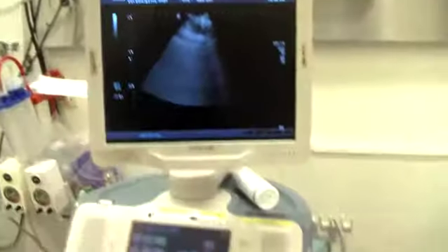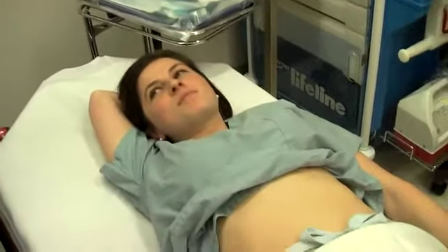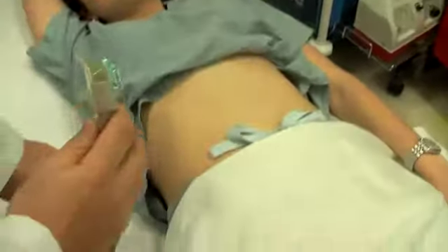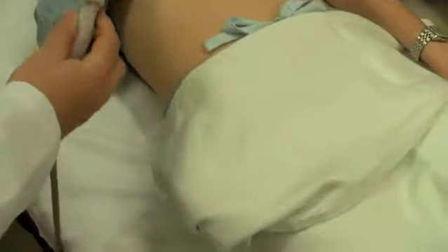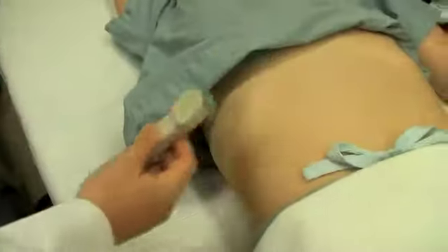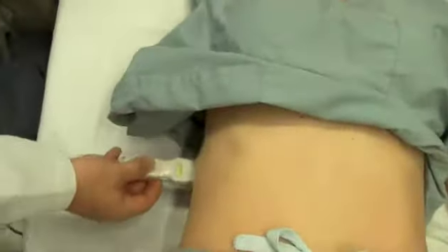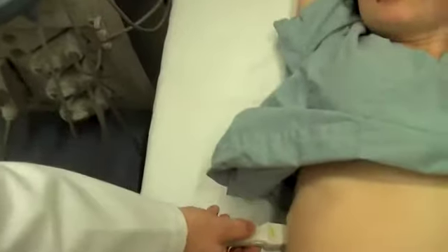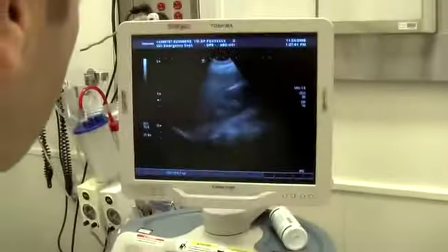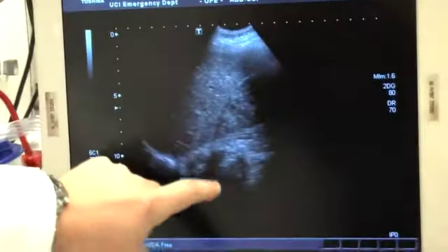Okay, so we're going to start with the FAST scan. In order to do the FAST scan, you're going to start with a coronal view of the right upper quadrant. The indicator is right here. It's going to be towards the patient's head, and you're going to start. It's going to be a little cold here. It's going to be kind of in between the ribs, and there's the liver. And this is the coronal view of the right upper quadrant. This is the liver, this is the kidney, this is Morrison's pouch, and this is the diaphragm right here.